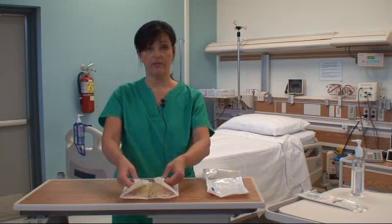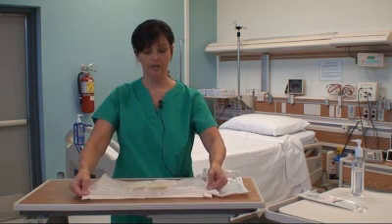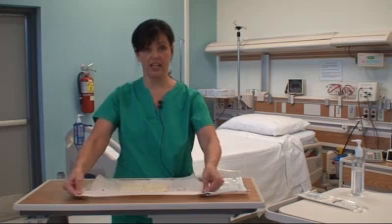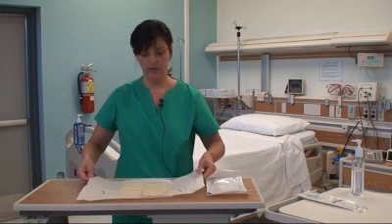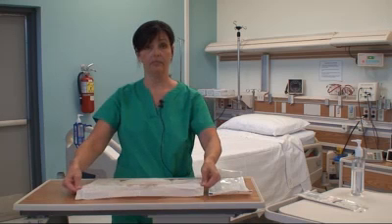There are two little flaps, and now I'm going to open those, making sure that I pull the packaging taut so that it lays flat and doesn't bend back over.